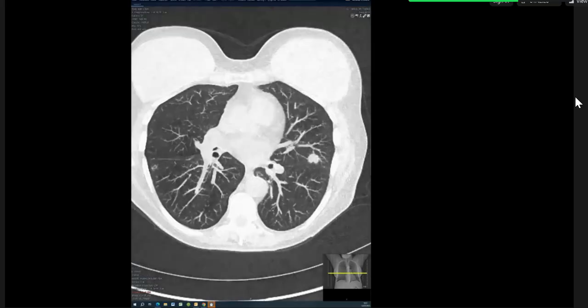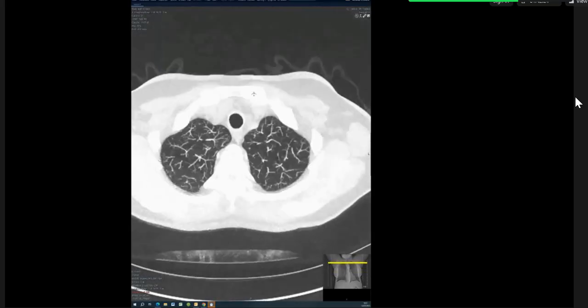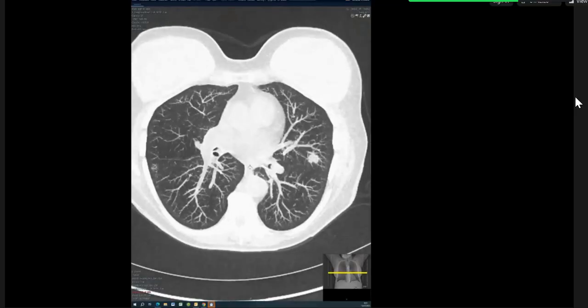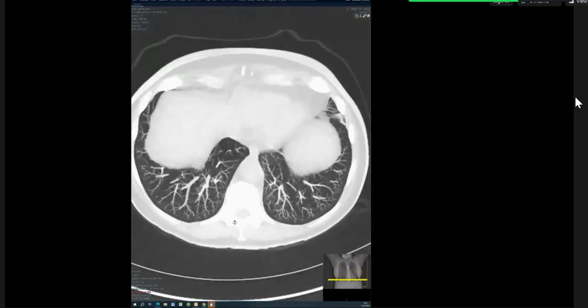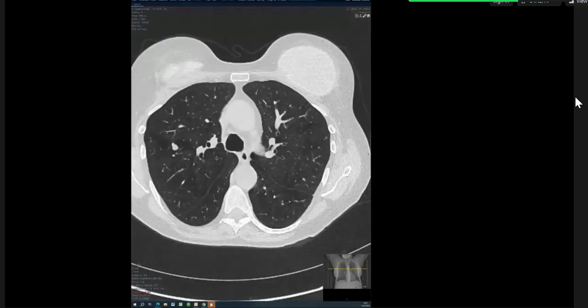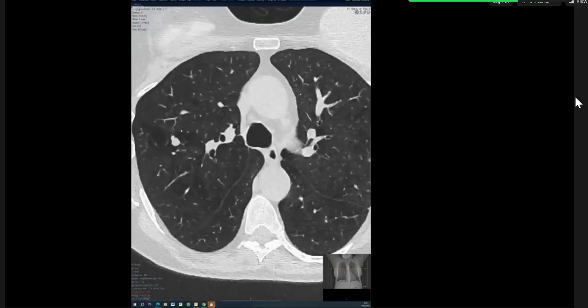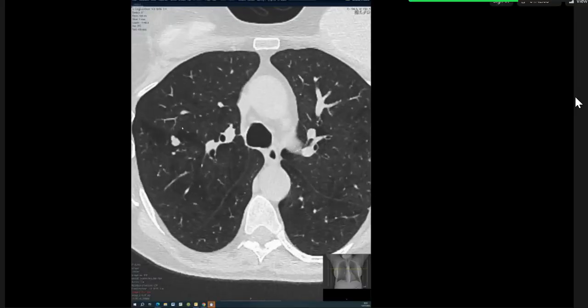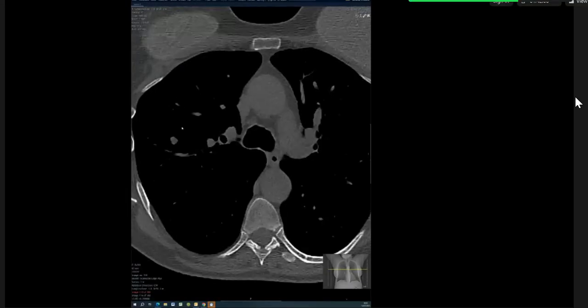So I'm going to map it so you can find anything else. Okay. So there's the nodule within the right middle zone that I saw on the chest. This one? Yeah. So you found 2 nodules, different size. What do you want to ask?